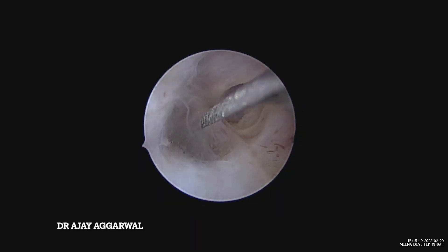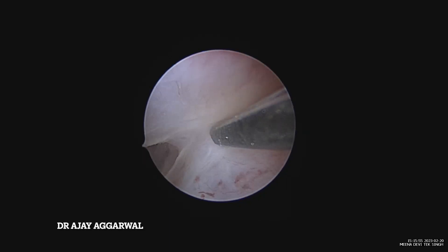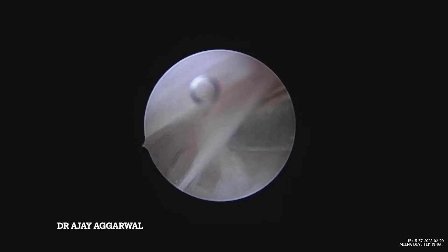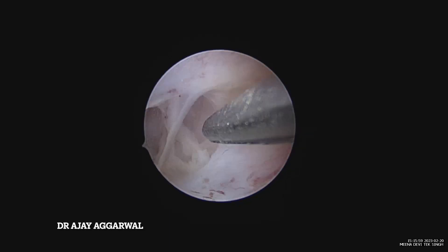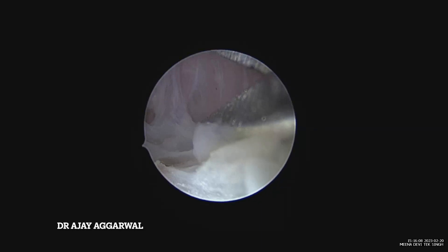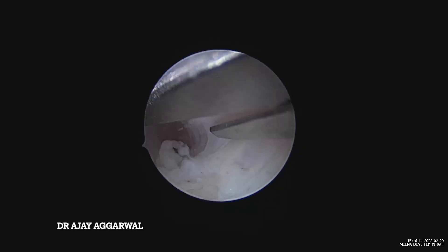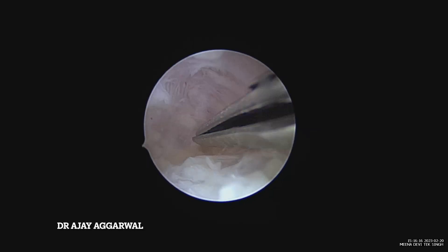We start our adhesiolysis with a standard step — the internal ostia — that I am opening with my scissor. The standard movement of my scissor has already been explained in my previous videos: I open the scissor vertically, make the adjacent bands thin, and then cut horizontally.